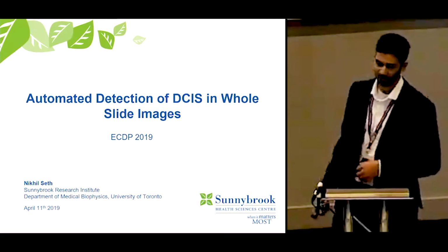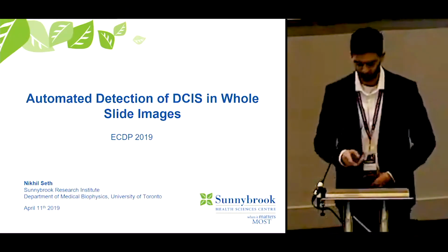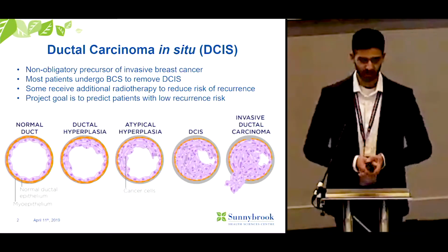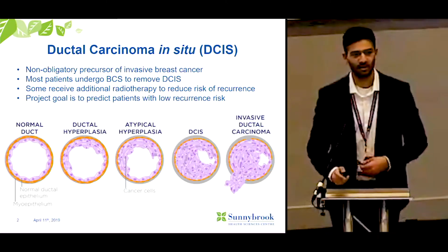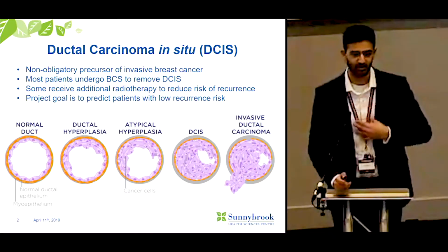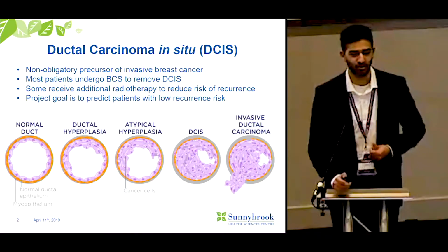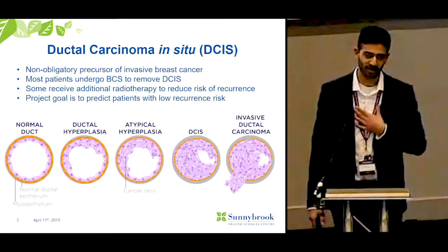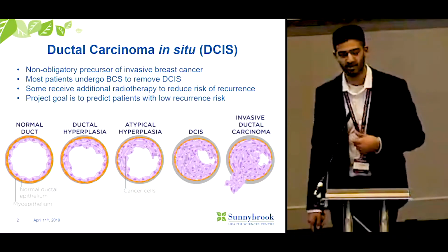My talk is titled Automated Detection of DCIS in Whole Slide Images. Ductal carcinoma in situ, or DCIS, is a non-obligatory precursor of invasive breast cancer. Most DCIS patients undergo breast-conserving surgery to have their tumors removed. However, some receive additional radiotherapy to reduce their risk of recurrence.